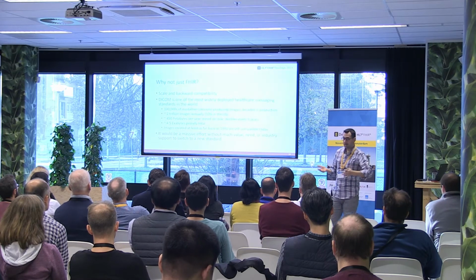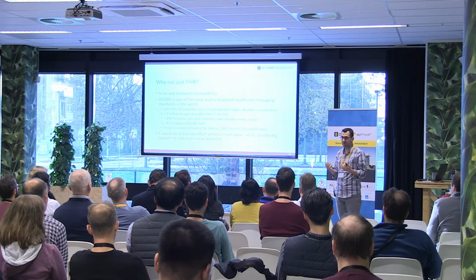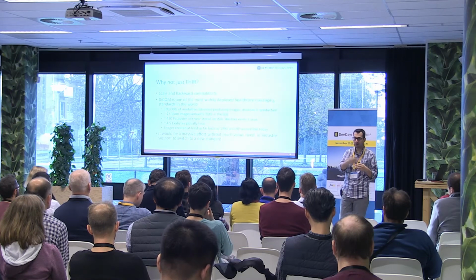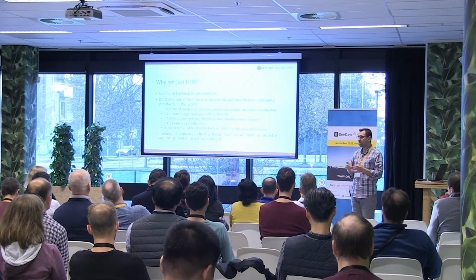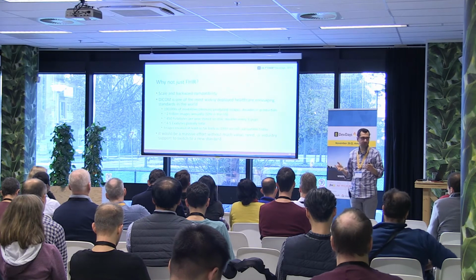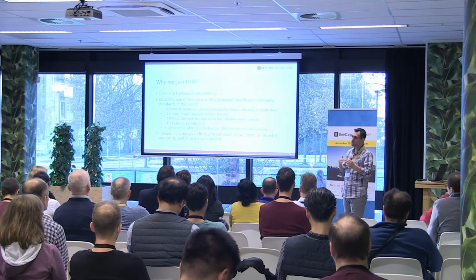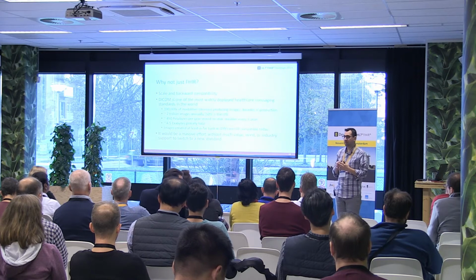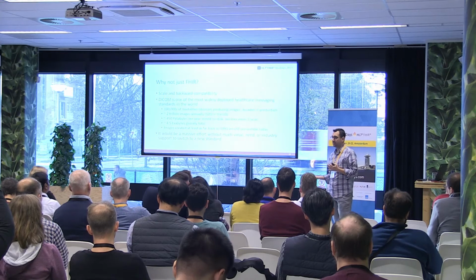You could then basically take an image that is 30 years old and still crack it open today in a viewer. Sure, the standard has moved on. There might be things in there that are deprecated, but nothing major. It still works. And it's actually very important because if you think about it, images are a very integral part of the record. And images also tend to be generally pretty big. So depending on, of course, which modality was used to perform the study, your images can be anywhere from several tens of megabytes to several gigabytes.